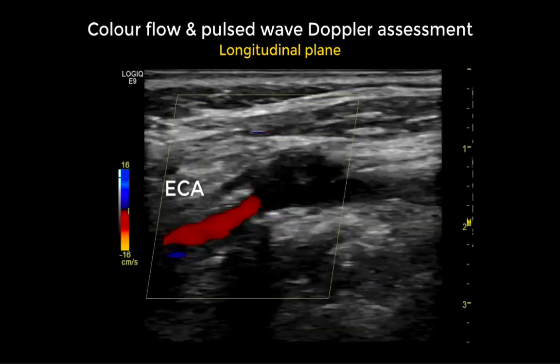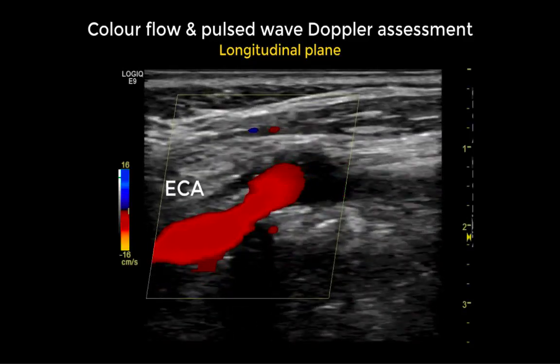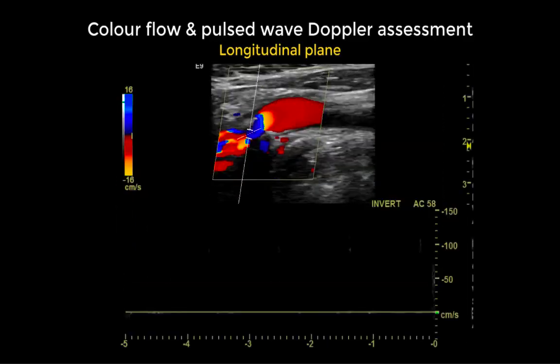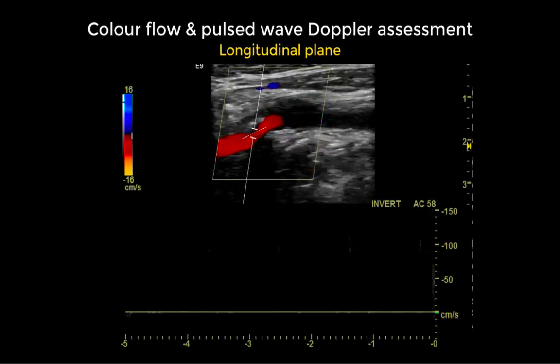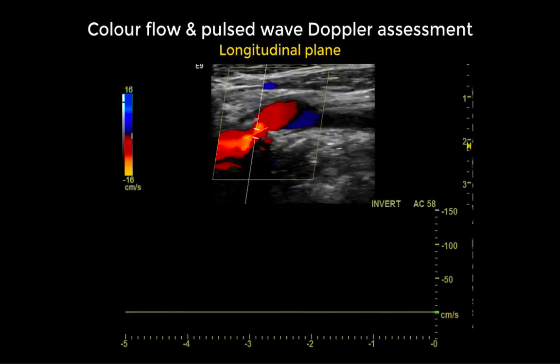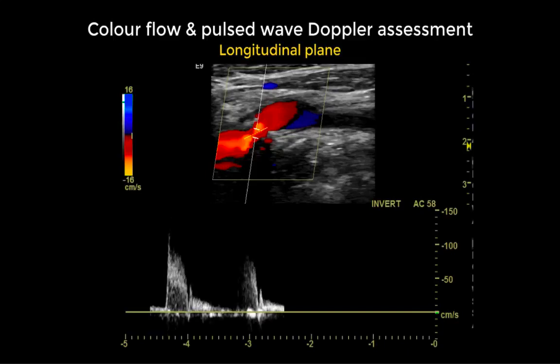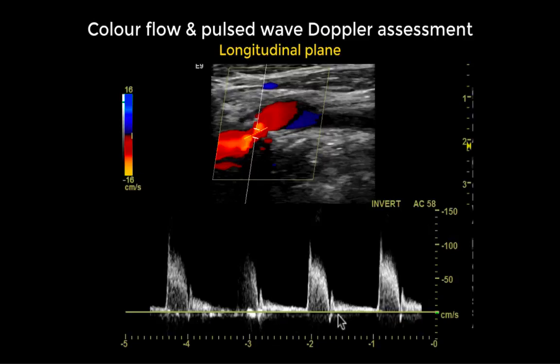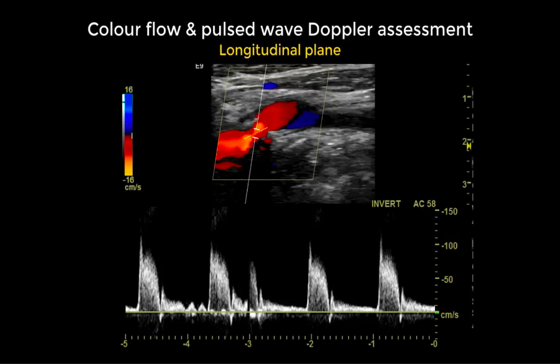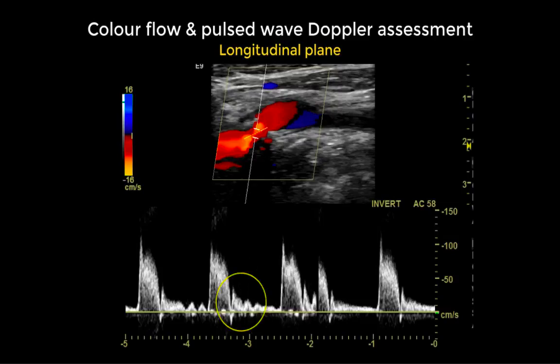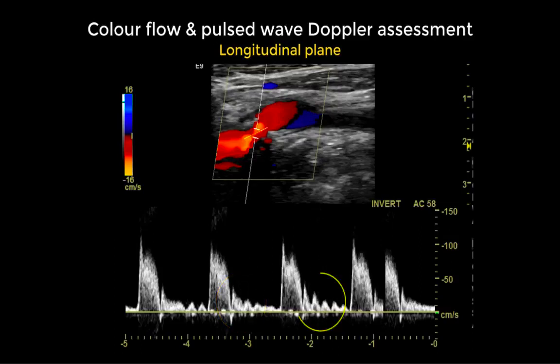We continue the assessment into the external carotid artery and confirm the anatomy using the Doppler mode. We place the sample volume within the origin of what we believe is the external carotid artery and see a normal high resistance waveform. We confirm this is the external carotid artery by applying the tapping maneuver, which shows alteration of the diastolic flow.